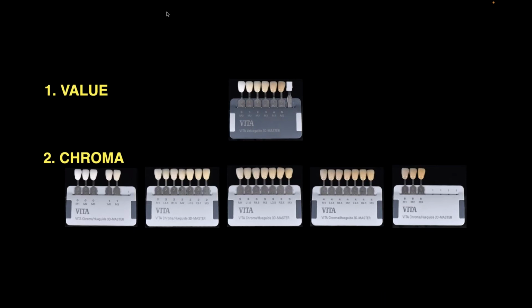After I pick value, I'm going to chroma. And I think the beauty of the system is how simple it works. So step one is I'm looking for my base value. Step two is, what is the chroma that I'm working with? And just to be clear with everybody on this shade system process, you have L's and R's. What do the L's mean? The L's mean really light, or I would argue yellow. Anytime I'm incorporating more lightness or more yellow into your shade tab, it means that you're getting a higher looking value because you're getting more light reflection.